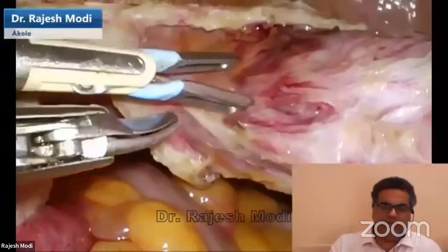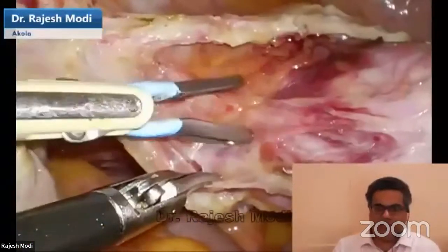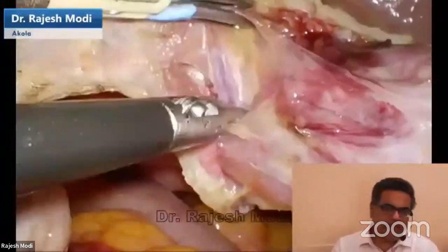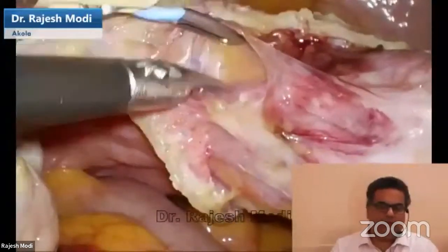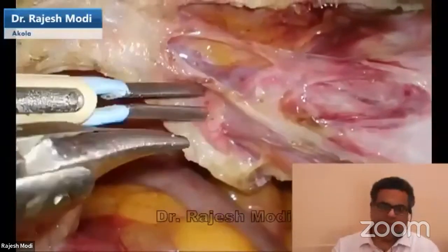You do not really need to dissect the ureter to prevent ureteric injury. You just need to be away from the lateral pelvic wall to prevent ureteric injury. And traction definitely is the key factor. I prefer to use the myoma screw. Some people prefer to use the uterine manipulator. Both the things are equally safe.